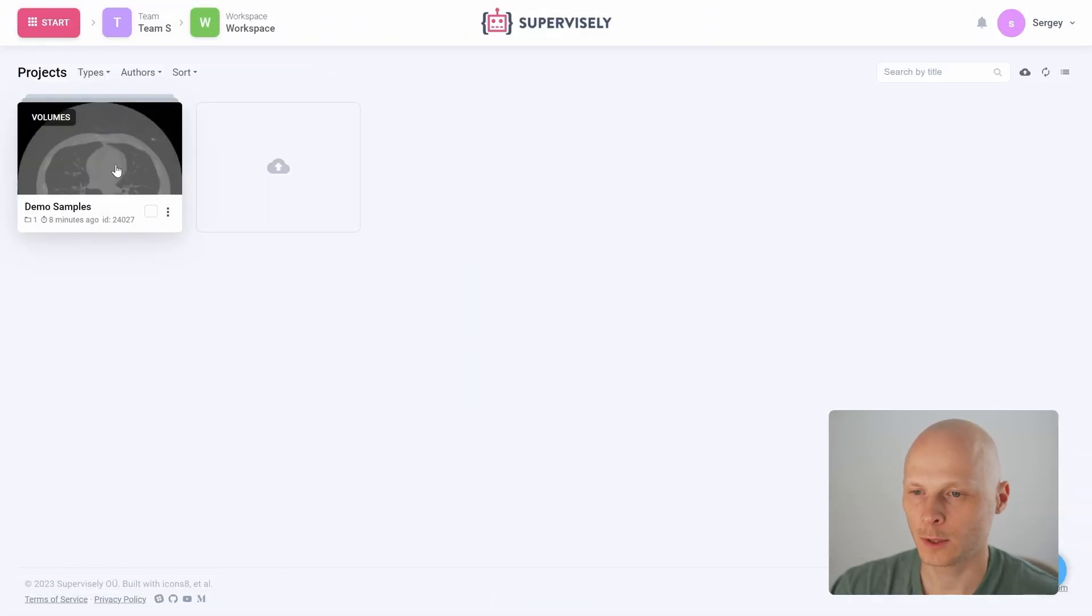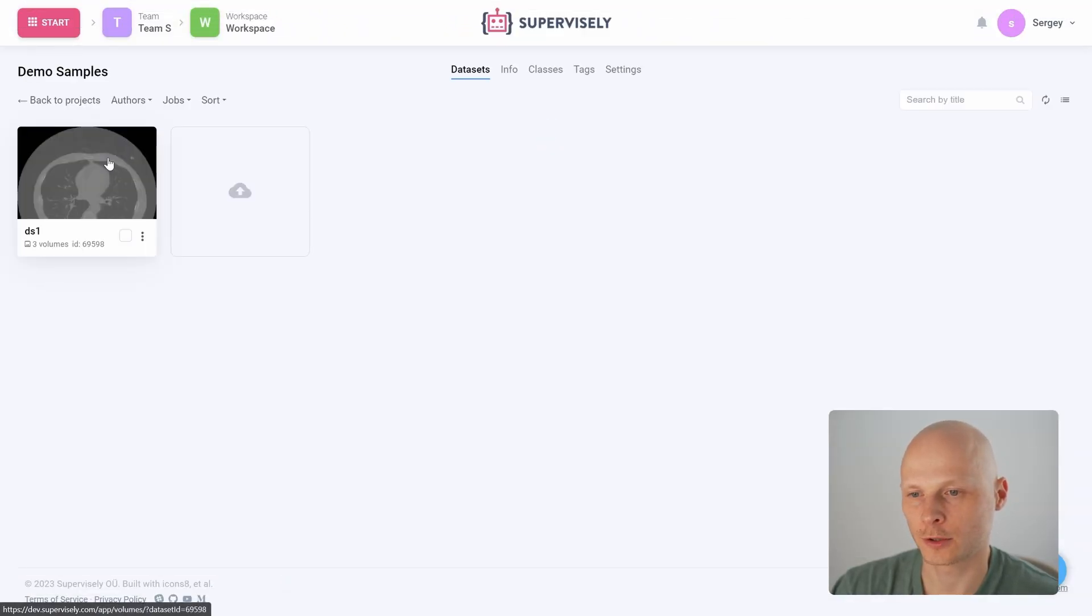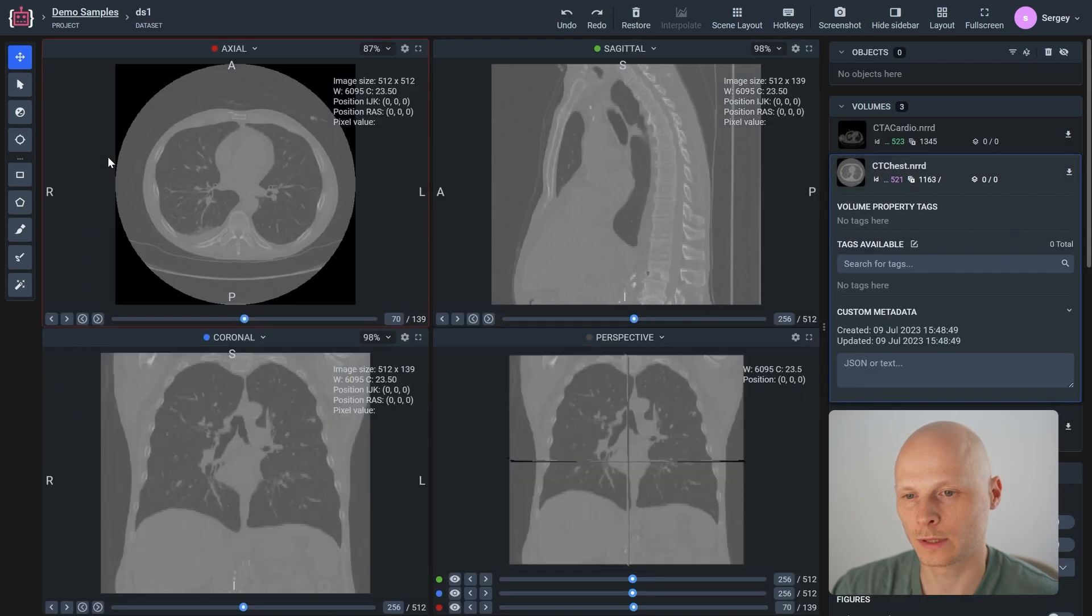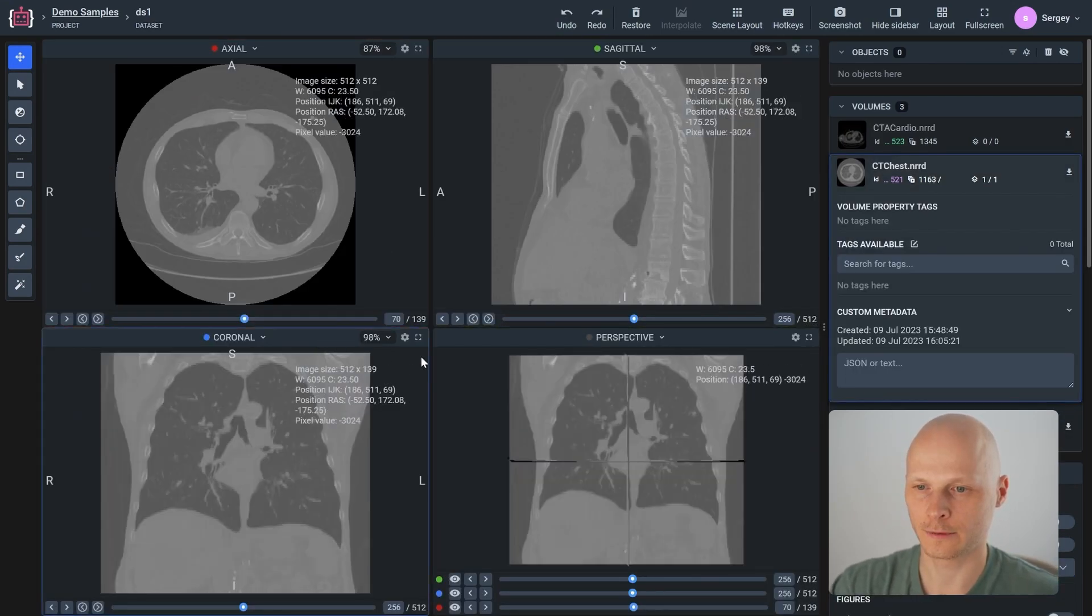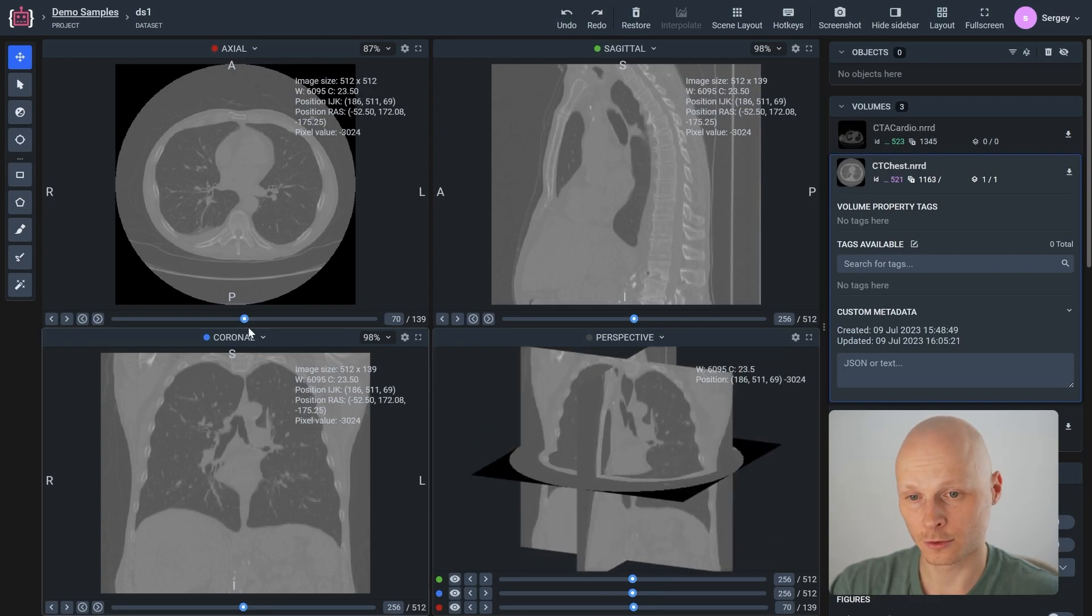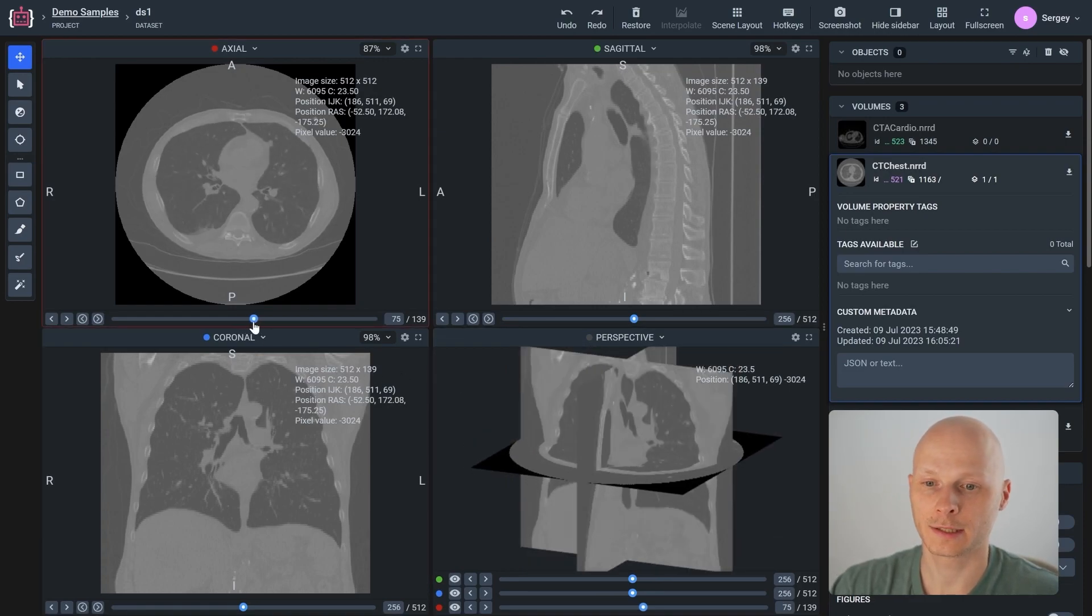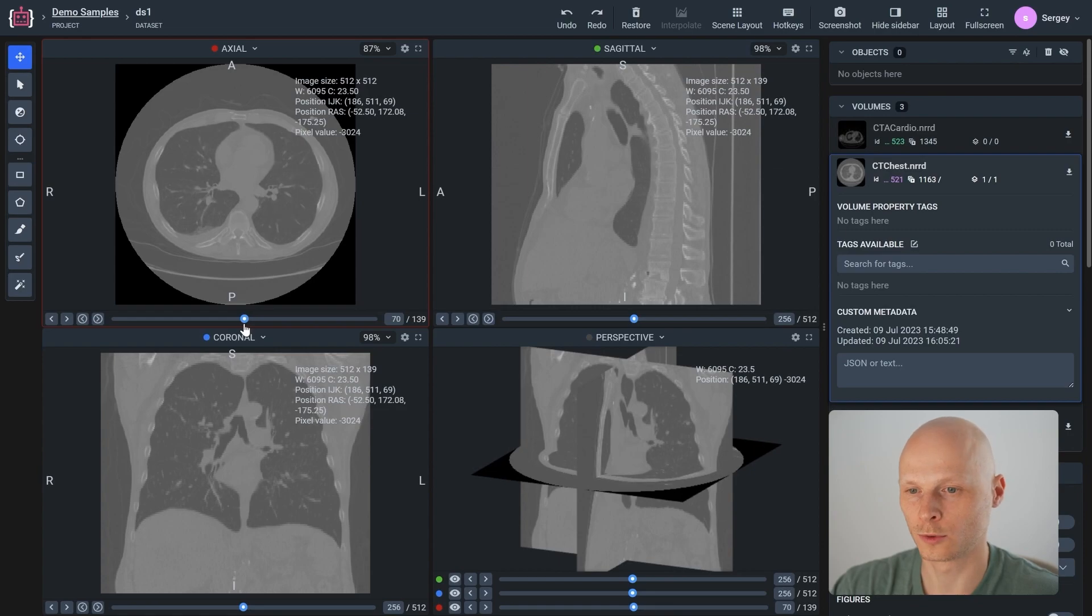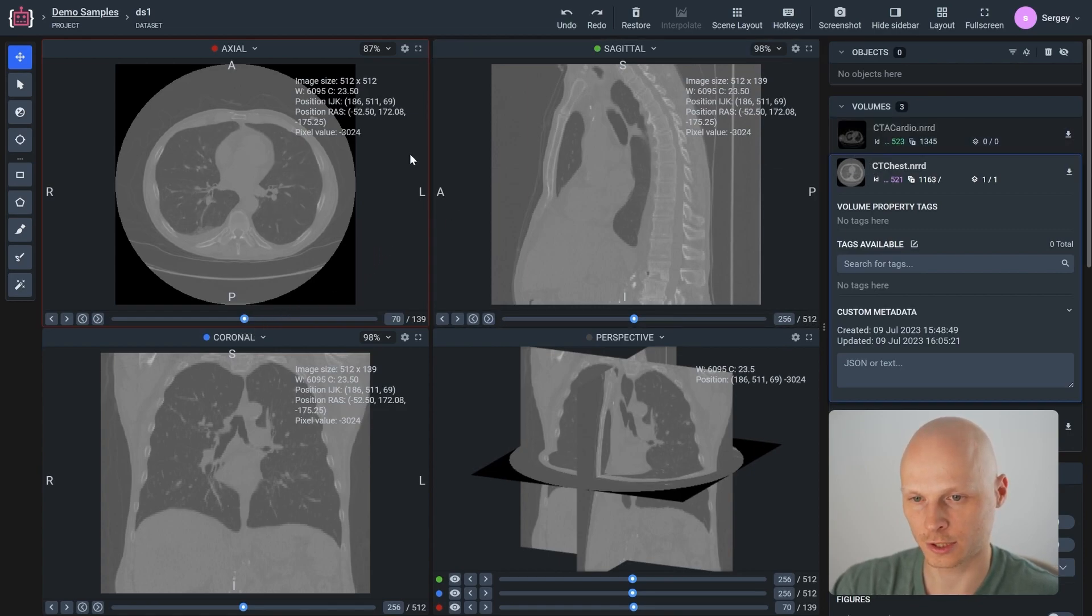Now I will show you how to work with DICOM labeling toolset and tell you about its key features. Let me open this project. Supervisely supports working with 3D objects out of the box. Here you can see different planes and 3D projection. Navigating through the interface is similar to well-known tools for physicians and doctors such as MITK and 3D Slicer.